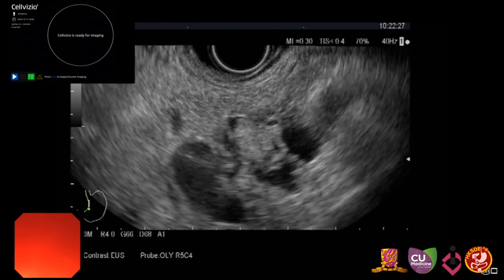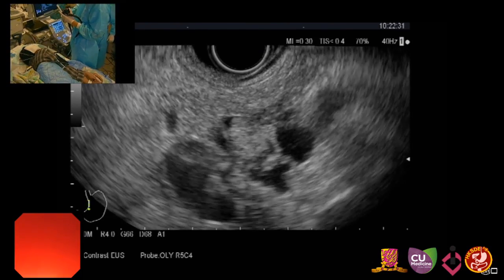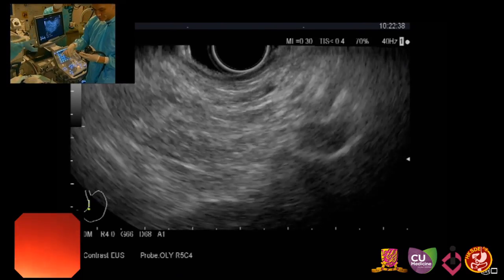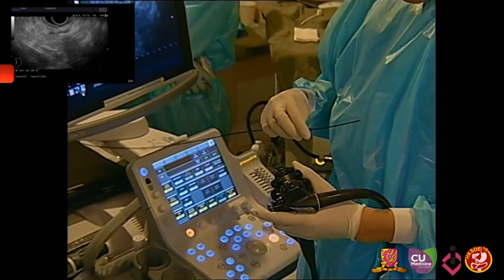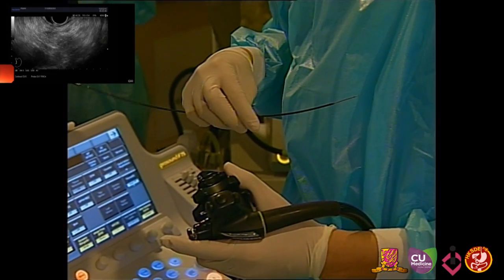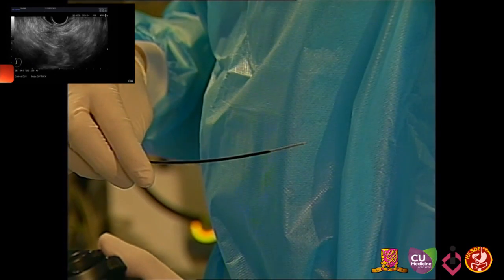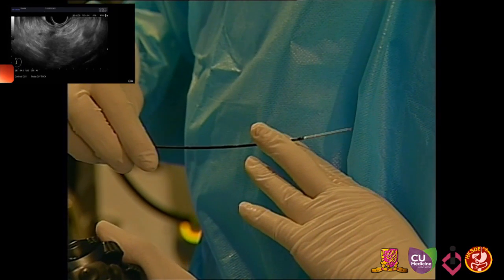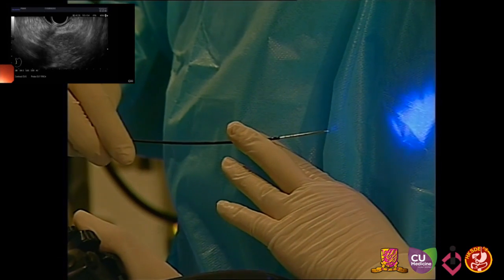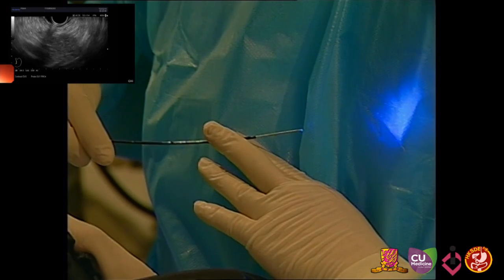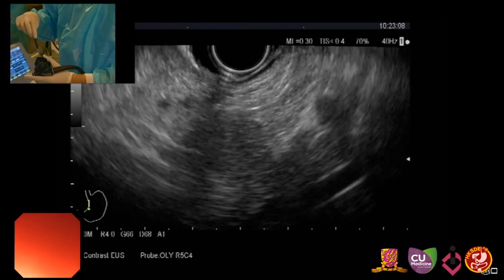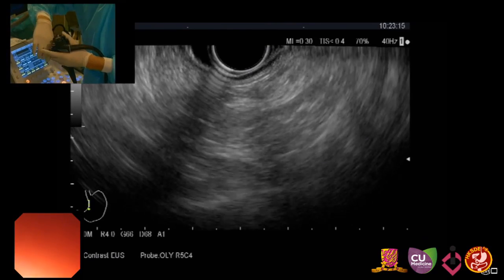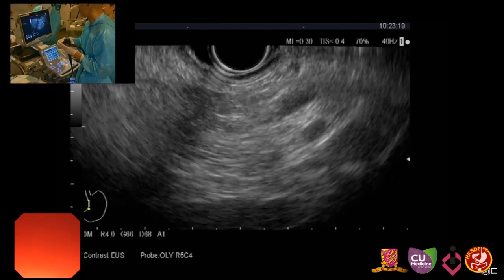Can you show the probe before you insert it? We've just pre-loaded it, so we're going to pull it out and then push out the needle and the probe. It's out about one millimeter — it's pretty small. You can see the blue light. It's a very delicate structure — we pull back the probe and then pull back the needle. How many times can you use this needle probe? Ten times — it's scheduled to expire after ten uses.